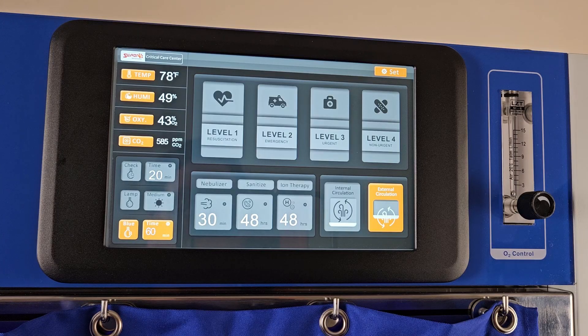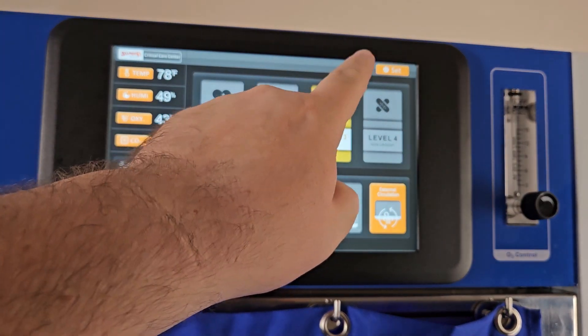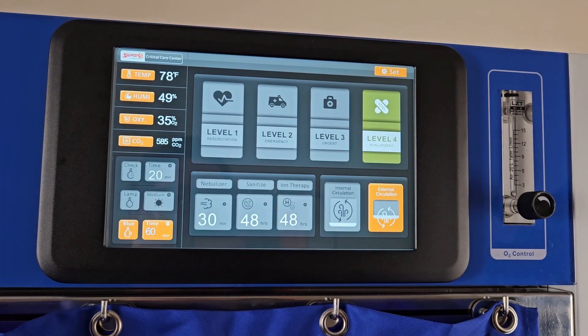The levels on the front of the unit are designed to be self-defined. Once pressed, a level will light up and can be changed by pressing any level in turn. After any level is touched, they will remain on until the unit is reset.